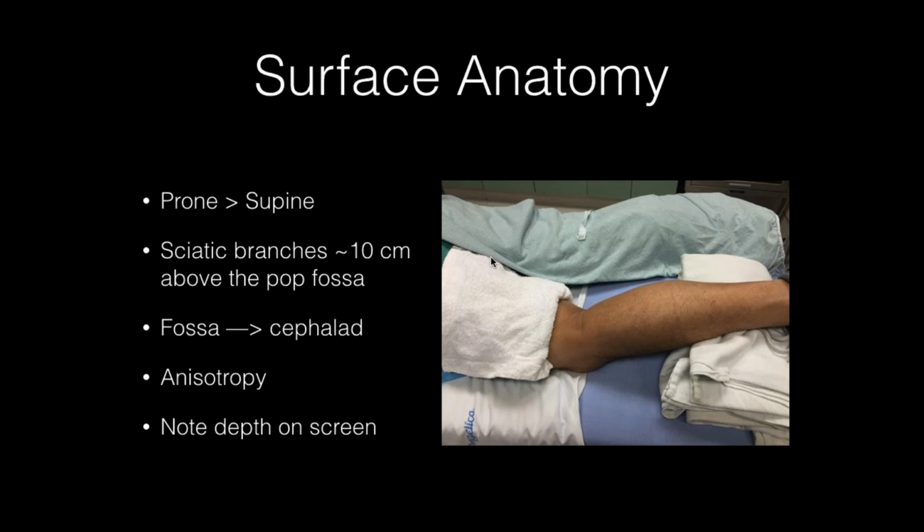And I tend to find the distal sciatic by starting in the popliteal fossa and doing the traditional view for DVT compression ultrasound and looking at the vasculature that way, and then isolating the tibial nerve, and then tracing that cephalad, where it is joined laterally by the peroneal nerve into the distal sciatic, because the sciatic itself is somewhat difficult initially to tell from the surrounding tissues.